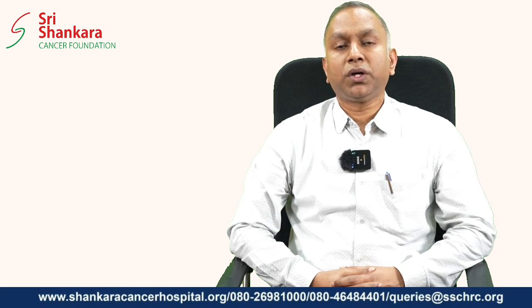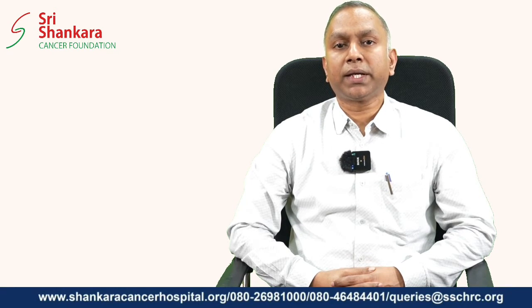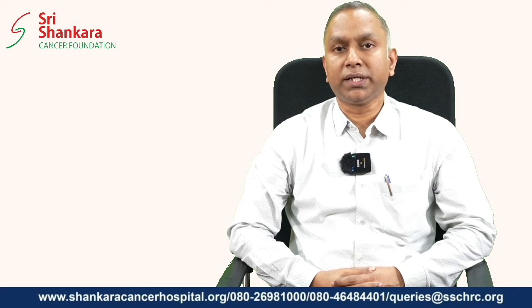The other type of brachytherapy is intraluminal brachytherapy. There are some organs which have a lumen, hollow or cylindrical structures, where an applicator can be passed through the organ, the radiation source can be passed through the applicator, and radiation can be delivered. The most common area where intraluminal brachytherapy is done is carcinoma esophagus. Another area could be biliary tract malignancies, where a percutaneous drainage tube would have been kept and through which the radiation sources will be passed to deliver the radiation.